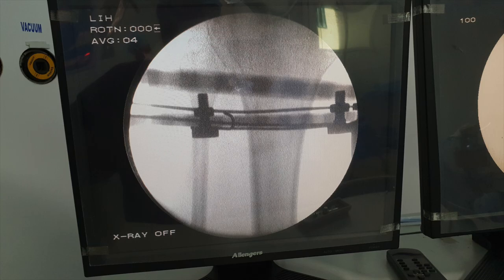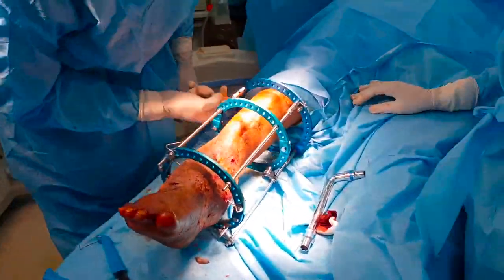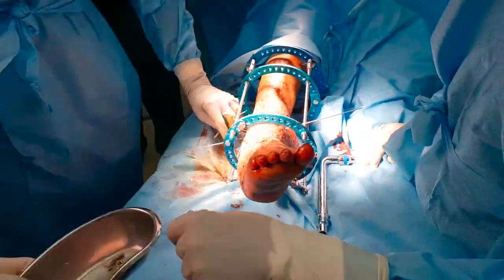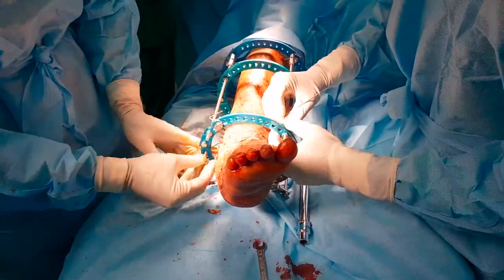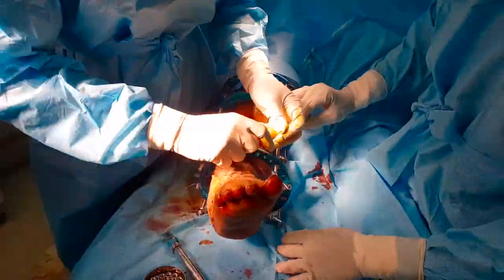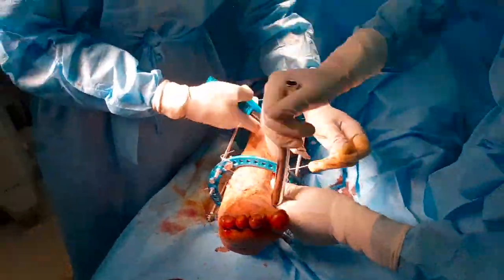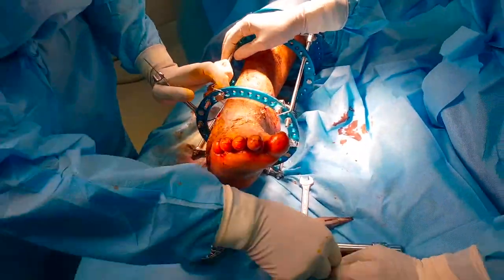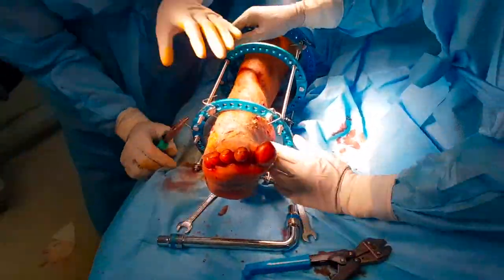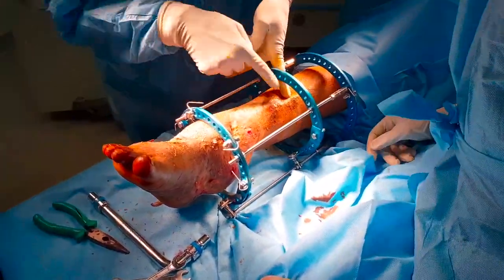Here we intend to perform a diaphysial corticotomy. Once the wires are tightened, we now pass the second wire, which is the perpendicular wire to the distal ring. This video shows all wires tensioned by the Russian tensioner. The method is simple — one end is tightened and then the nut itself is turned by 90 degrees so that the wire assumes a stretched position with a tinny noise.